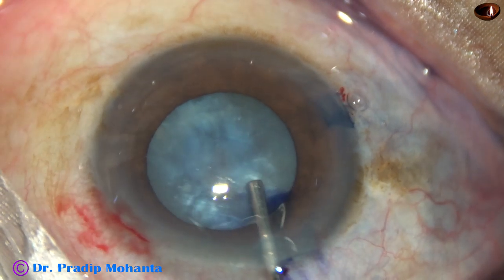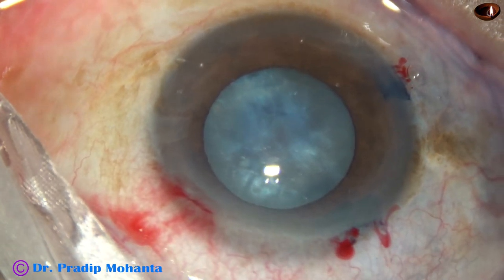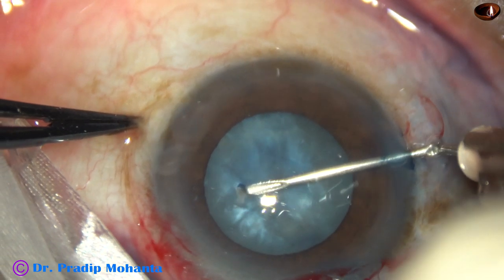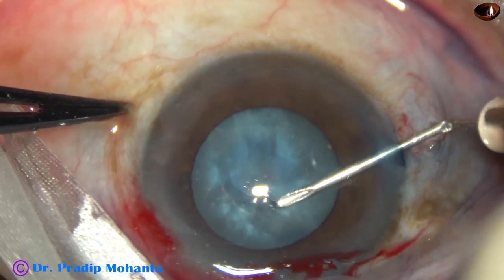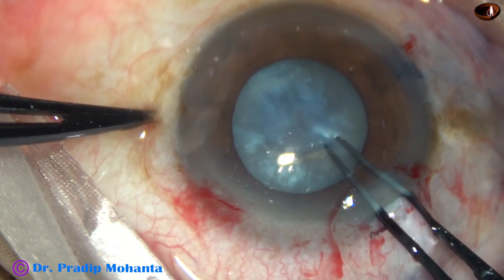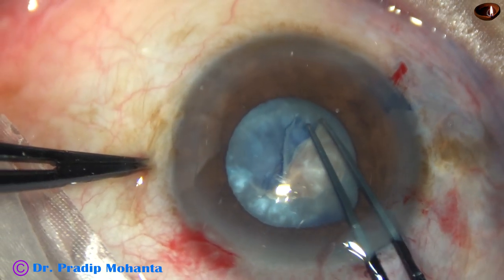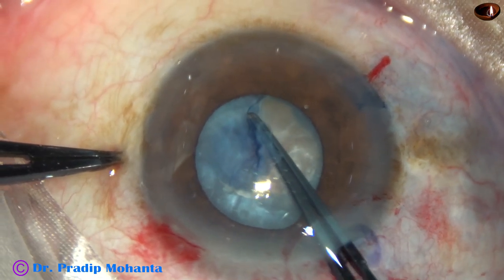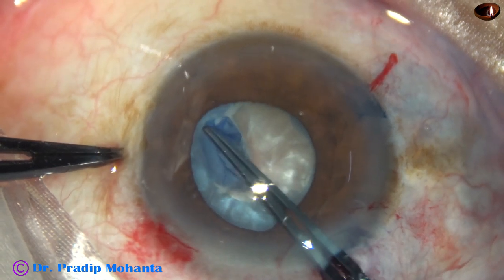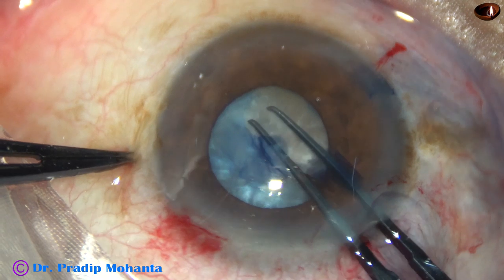2% HPMC is injected into the anterior chamber, and now I am attempting capsulorrhexis. A 26-gauge bent needle is introduced. A cut is made just at the periphery of this fibrous tissue at 1 o'clock, and now I try to do the rhexis. As I go to 6 o'clock, it tends to go to the periphery, but I could retrieve it.